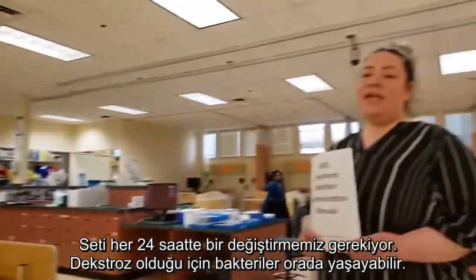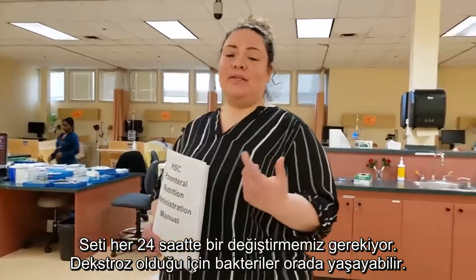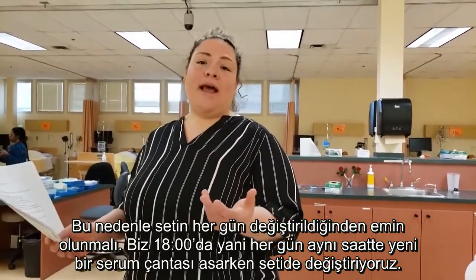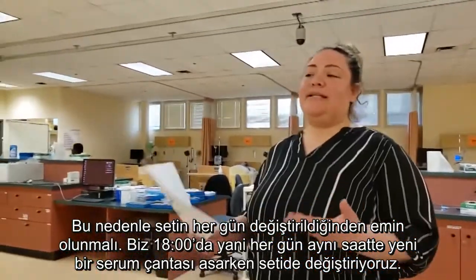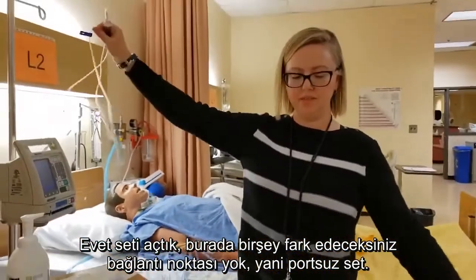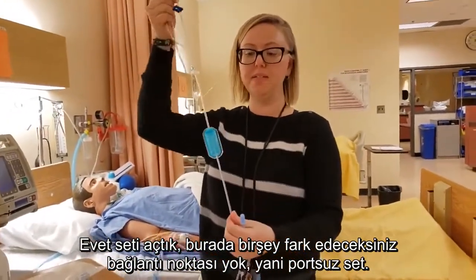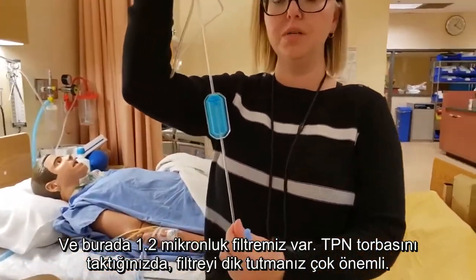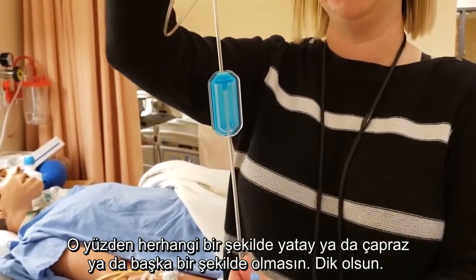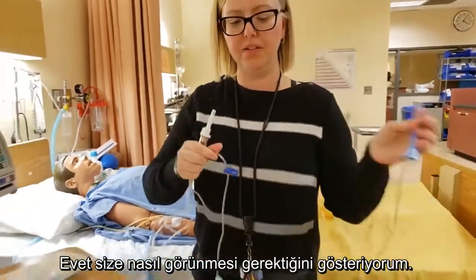Tubing gets changed every 24 hours, because bacteria will live in that tubing due to the dextrose. So we want to make sure we change our tubing every day. Usually 1800 is when they run TPN — so at 1800 when you hang a new bag, you change your tubing. Once you've got your tubing out, you'll notice a couple of things: it has no ports — it's portless tubing. And here is that 1.2 micron filter. Once you spike the bag on your TPN, it is very important that you keep the filter upright while you're priming your tubing.